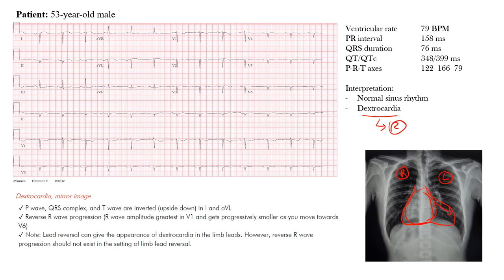In this patient, the rate is normal — between 60 and 100. We have a normal PR interval, normal QRS duration, and the QT and QTc intervals are normal. Notice that the R axis or ventricular axis is 166 — so if you draw out the axis chart, this would be positive 166.